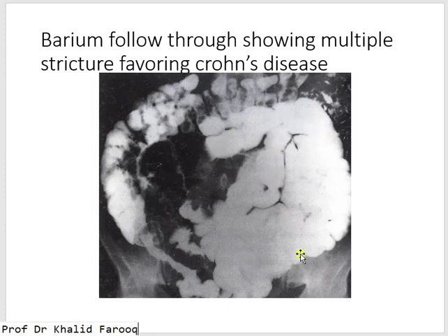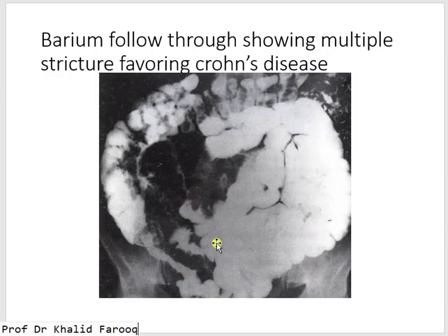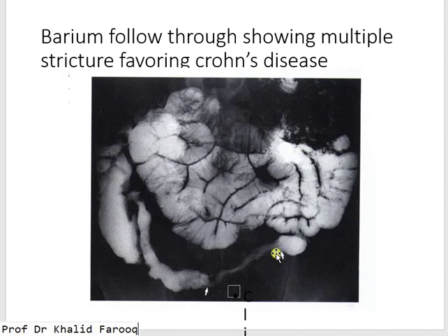On another barium follow-through examination, there is prominent hold-up of contrast in the jejunum and evidence of strictures — number one, two, three, and four — with normal intervening areas, that is skip lesions. This is because of Crohn's disease. Another example of Crohn's disease shows proximal hold-up of contrast with dilated small bowel, with one stricture in a relatively normal area and another stricture in the distal portion.